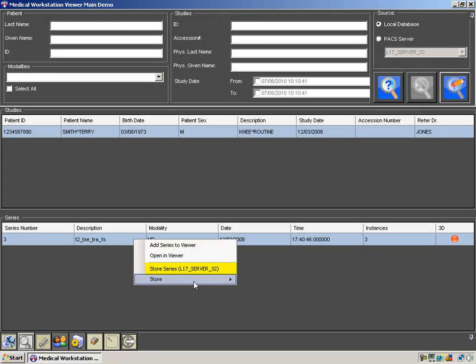You can store using the default storage server, or you can select a remote PACS from this list of servers. Select the L17 server 32 PACS.